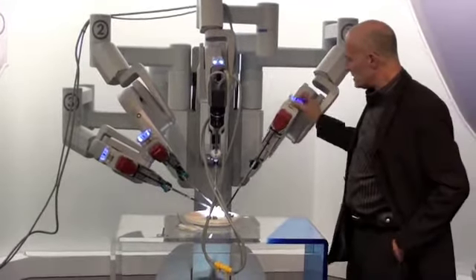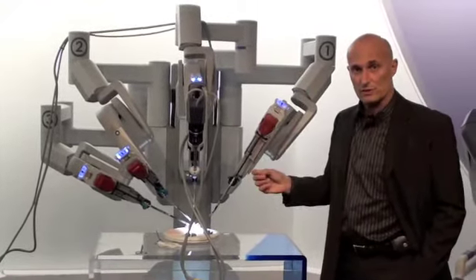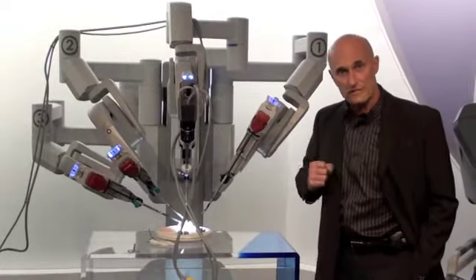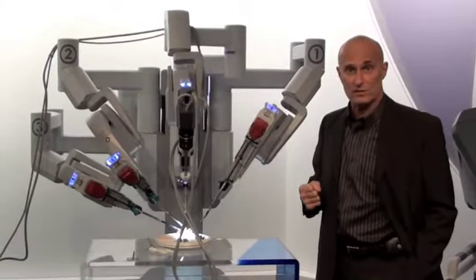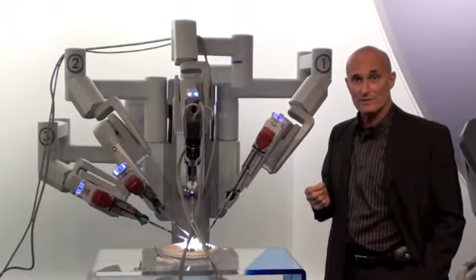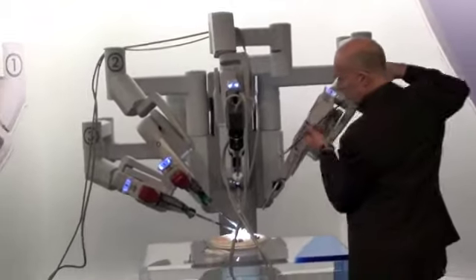The purpose of this system is to bring precision and control from the surgeon to the patient. People think that a robot is something that's going to be doing something. This device does exactly what the surgeon intends it to do in a very precise way under high definition, binocular, 3D magnification, and what is referred to as endo-wristed instruments.